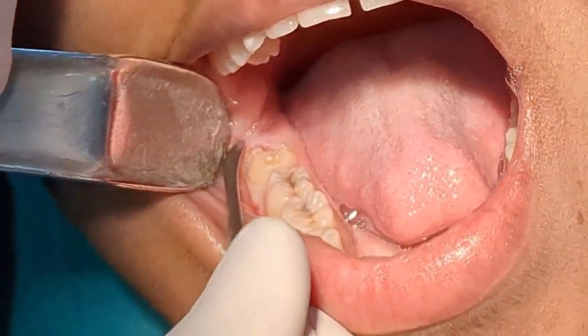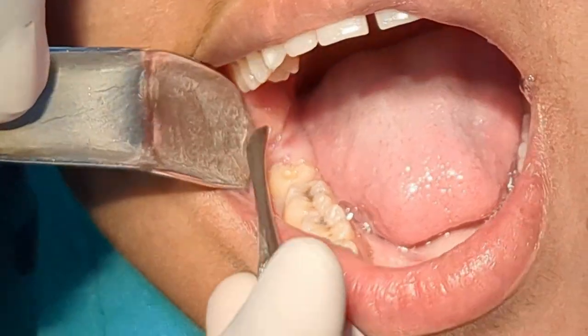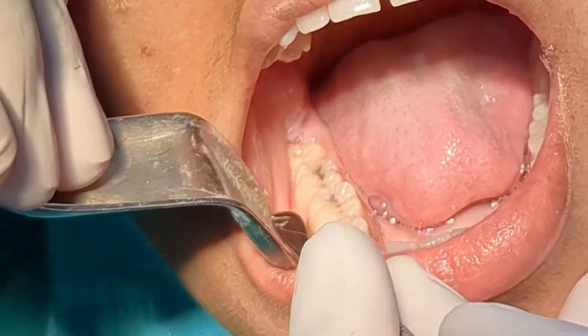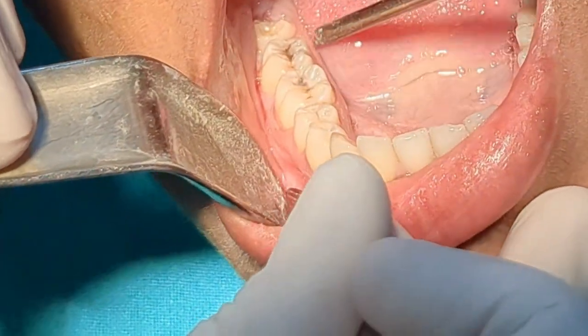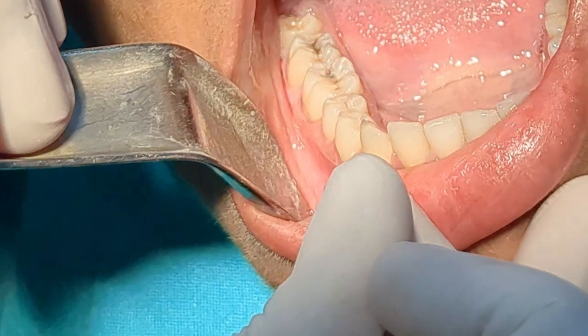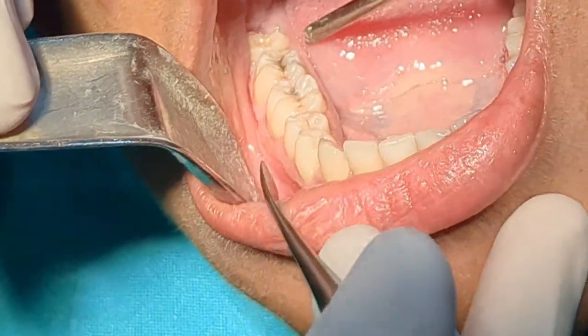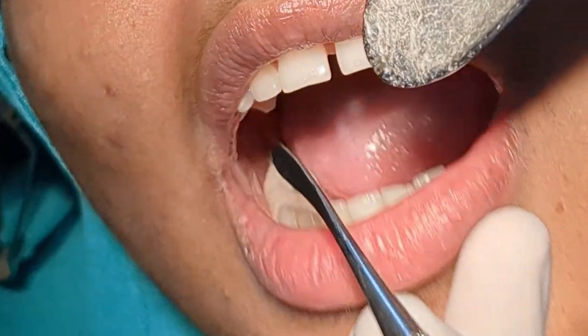Here I am checking for the effect of the buccal nerve block. Now I am checking for the effect of the inferior alveolar nerve block. On the lingual soft tissue, I check for the effect of the lingual nerve block.